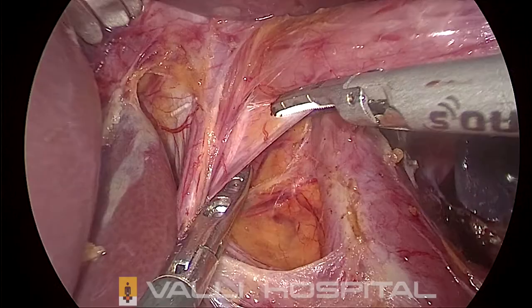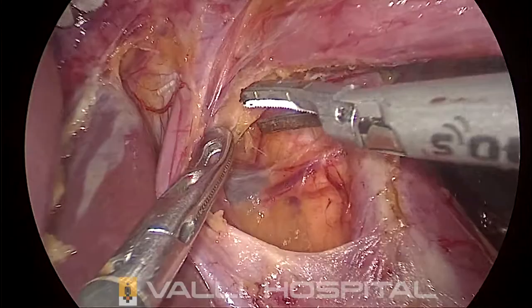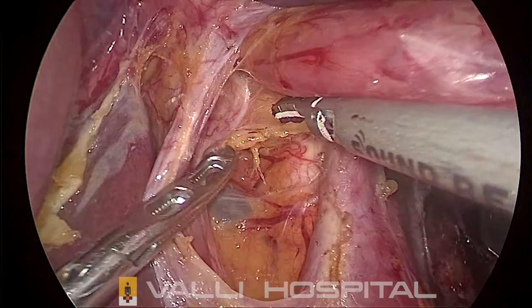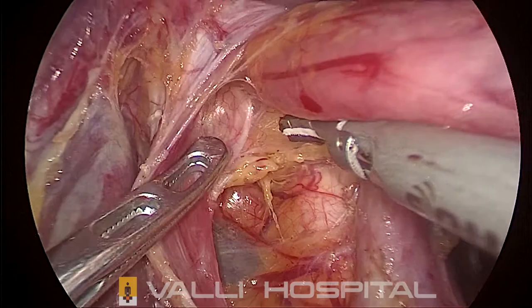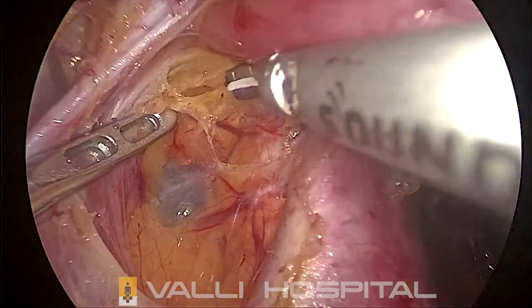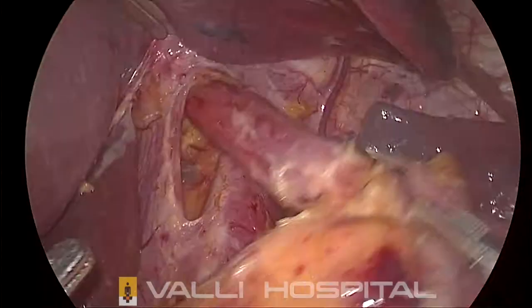You have to be careful here about the posterior vagus and the pleura. You must safeguard the pleura. See, you can see the pleura there. You safeguard with your left hand and then dissect. Even if you make a small nick, it doesn't matter, because the positive pressure ventilation will not allow the air to go inside the chest mostly if the rent is smaller. So you need to be careful about the pleura and the posterior vagus.